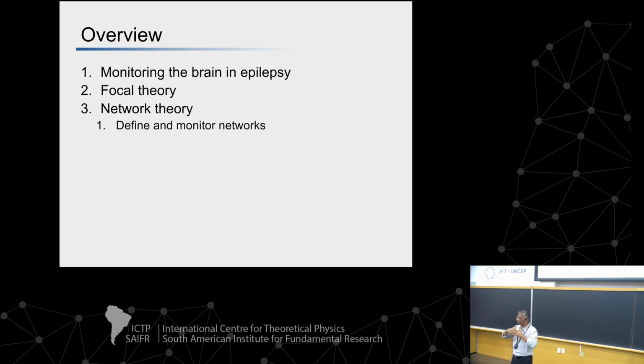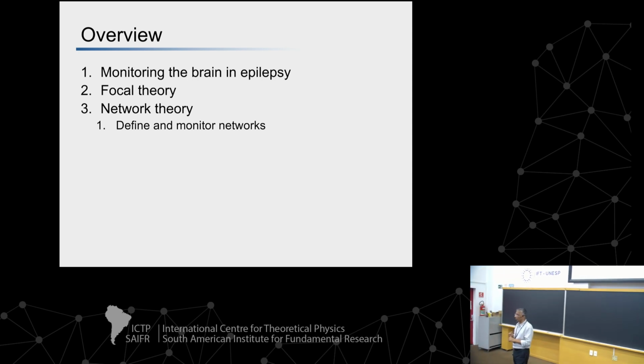But if you saw the slide that Klaus presented yesterday, there is almost a disconnection between the unit activity and the macro signal, the EEG signal. All our clinical decision making is based on the macro signal. The unit activity becomes more difficult. I mean, which neurons, where do you place this? How many neurons can you capture, and for how long? The Utah electrode array is great, but it was designed in the last century, essentially, and we haven't had the next generation of that ready for human use, or more extended human use.